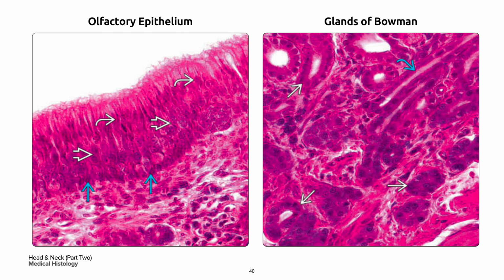On your right are the olfactory glands in a single white arrow, which are unique to the olfactory region. They are tubuloalveolar serous glands that may have lipofuscin pigment in the cytoplasm. They drain into a small central duct in curved blue arrow.